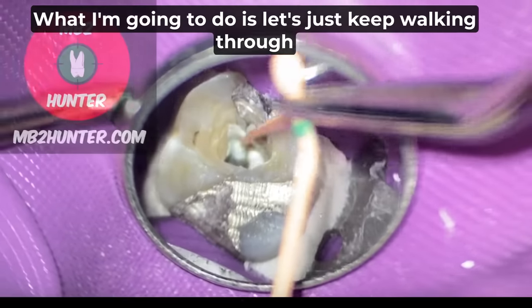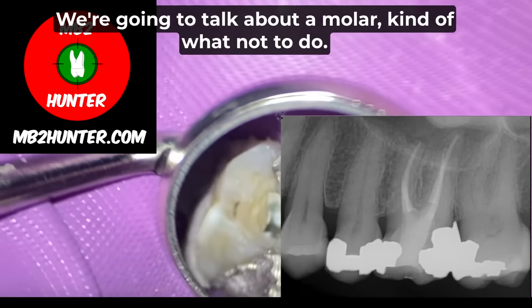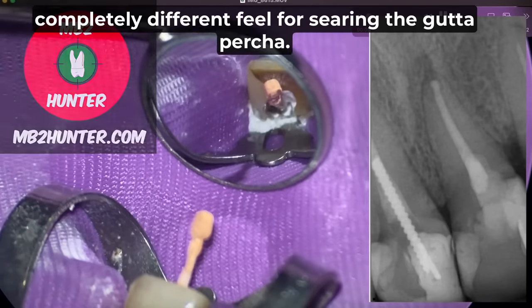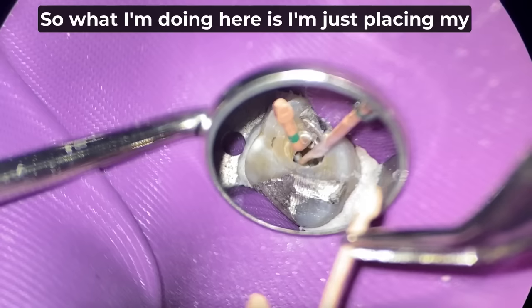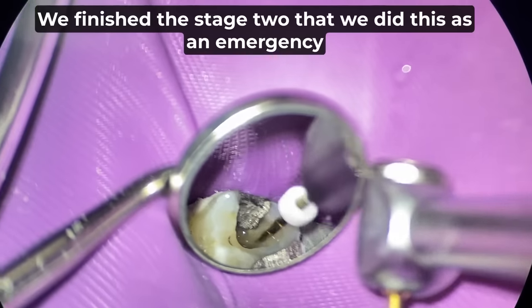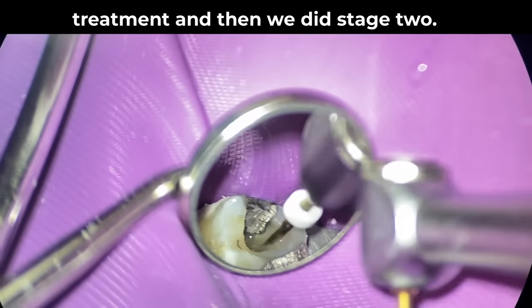What I'm going to do is keep walking through the case as we talk about it. I've got two cases. We're going to talk about a molar, kind of what not to do, and then a central incisor, which has a completely different feel for searing the gutta percha. Here I'm placing my cones into this maxillary first molar. We finished stage two; we did this as an emergency treatment, and then we did stage two.